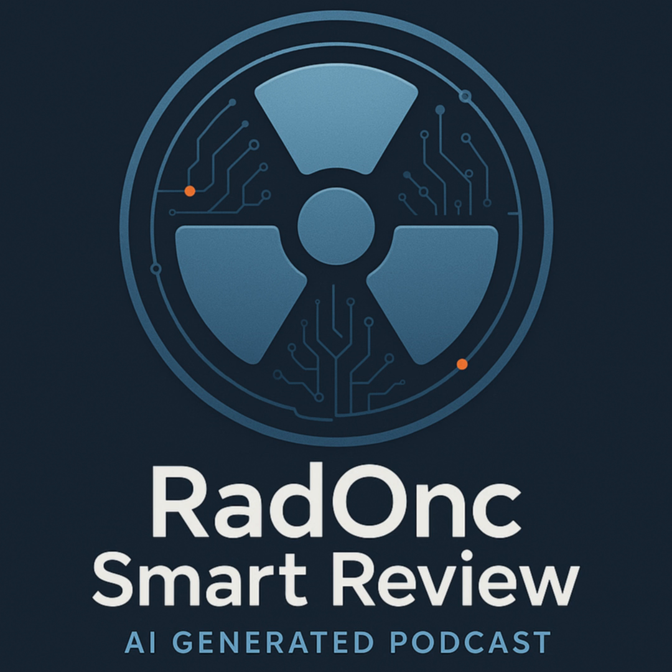Wow. Yeah. And it's particularly problematic for lower energy electron beams because they tend to undergo larger angle scattering more readily. So, classic example. Treating a cancer on the lip or the inside of the cheek with maybe 6 MeV electrons, and the patient has big metal fillings or crowns right behind that tissue. Exactly. In that scenario, the inner surface of the lip or the buccal mucosa right next to that metal filling could get a substantial overdose due to backscatter. Which could lead to nasty side effects, right? Yeah. Like severe mucositis or even tissue breakdown. Absolutely. It can cause significant complications if it's not anticipated and managed.